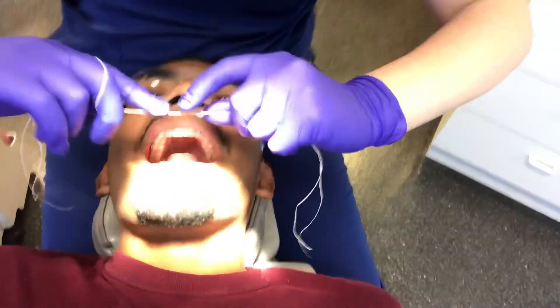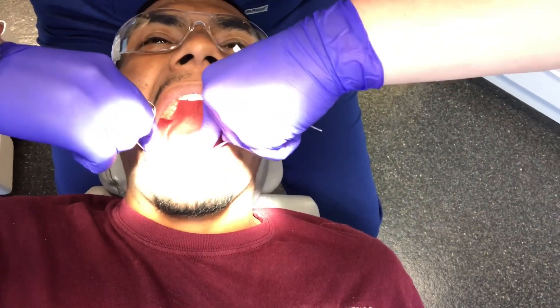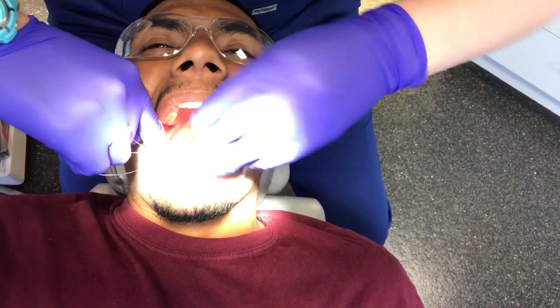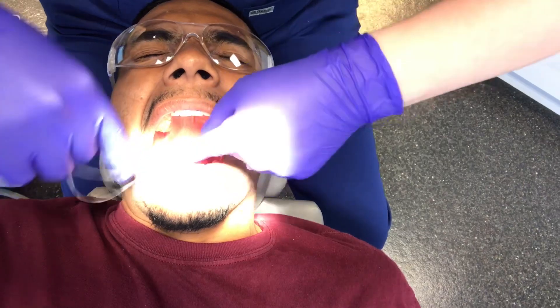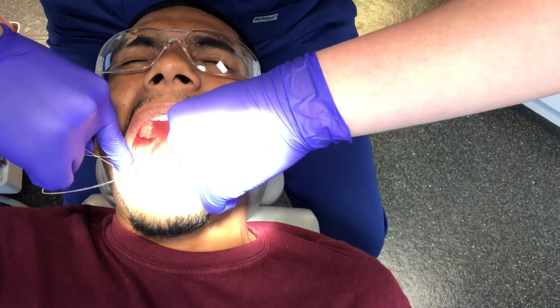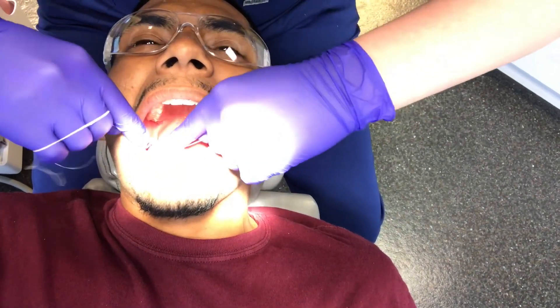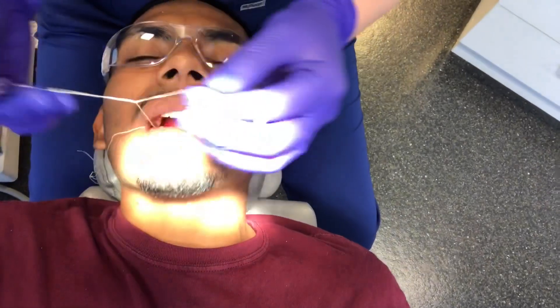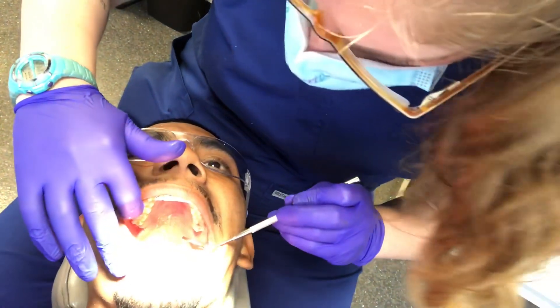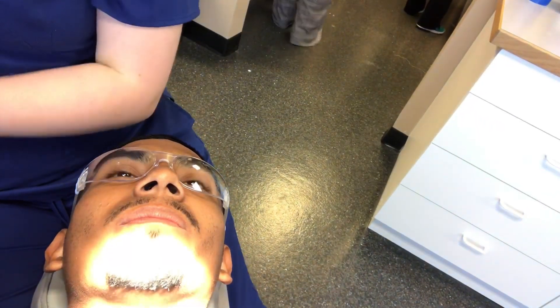Ibuprofen will be your new friend for today and probably tomorrow. Last one on the bottom here. Same thing, just floss. There's the pressure. That's it. A little wiggle. Good job. Relax for a second. All done there. I'm done torturing your bottom teeth, I promise.